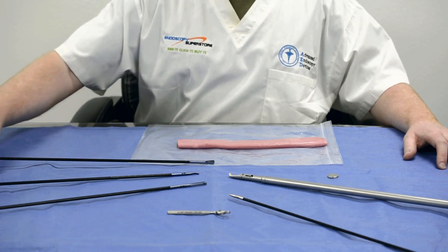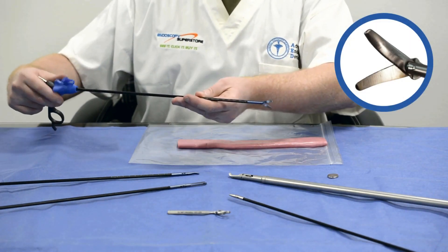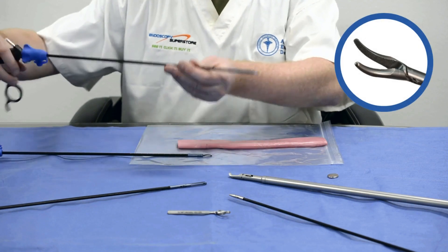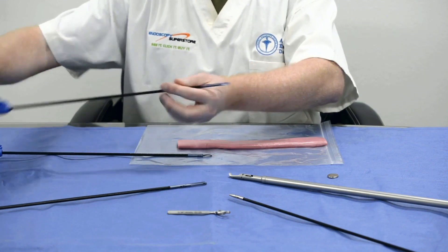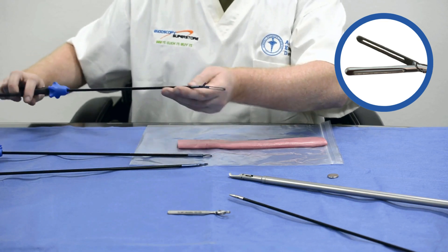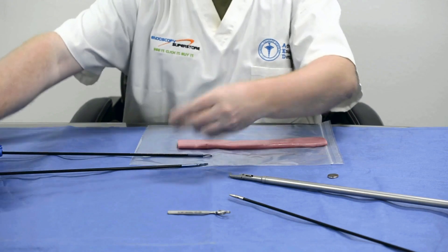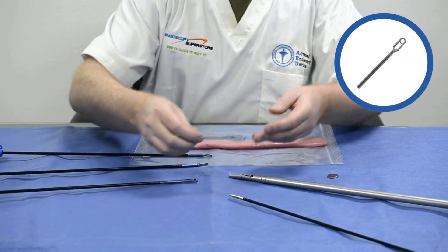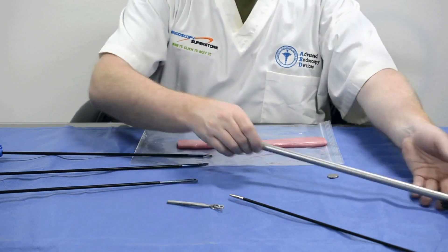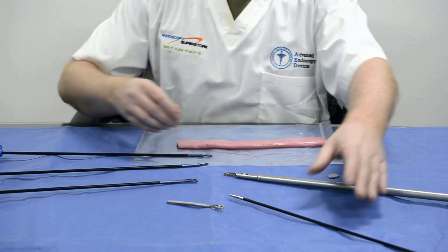We've developed three specific patterns for this project. We have a curved MET scissor, a Maryland grasper, and a bowel grasper with very fine micro serrations to minimize trauma to the bowel. We also have a non-magnetic bulldog clamp, a non-magnetic plier, and an axial needle holder.